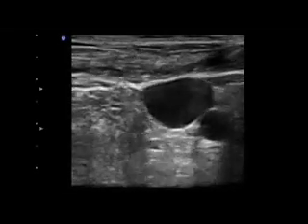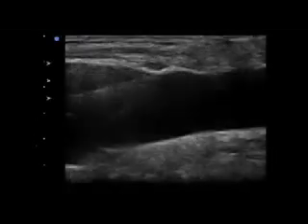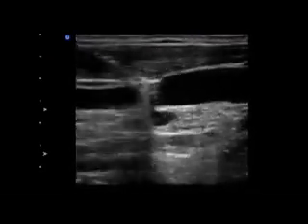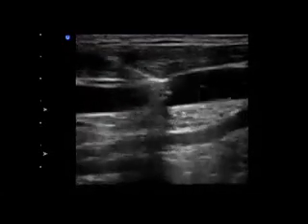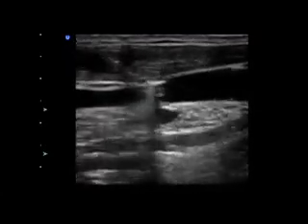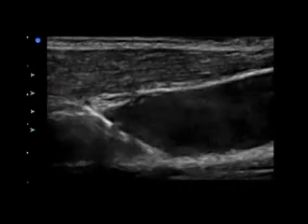For the longitudinal approach, be sure to differentiate the vein from the artery by locating both vessels in the transverse orientation. Then turn the probe 90 degrees to visualize just the vein in the long axis. The marker dot should align so that the left side of the monitor is cephalad. Enter the skin just adjacent to the end of the probe and advance at about a 45-degree angle. When the needle is about 1 centimeter deep, look for the needle tip on the monitor. Then advance the tip of the needle into the vein under direct visualization. When the needle tip is in the vein, advance the wire and watch it pass into the vein.